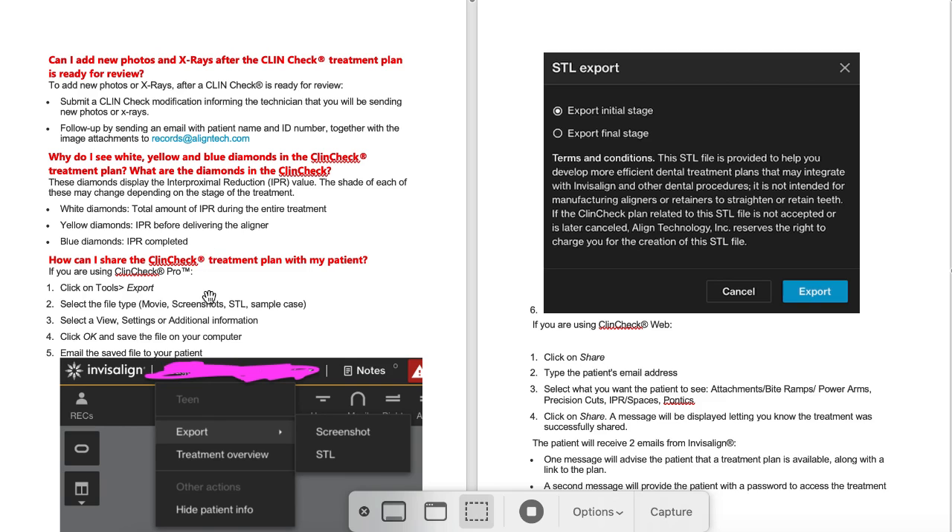A really popular question: how do I share my ClinCheck with a patient? This is a new feature. I'm having some issues with it — maybe it's because I have a Mac — but they have two different workflows: one if you have ClinCheck Pro, one if you don't. When I go to the newest ClinCheck and click on the patient's name, it's going to show the treatment type, then an export option which is supposed to say movie, screenshots, STL, or sample case. Mine only shows screenshots and STL.